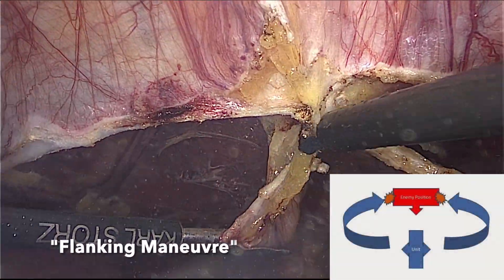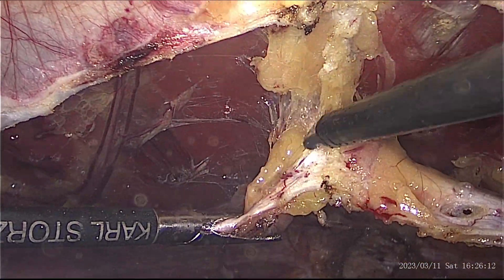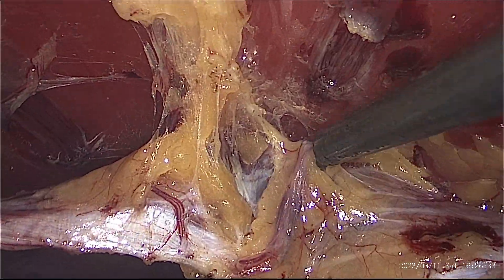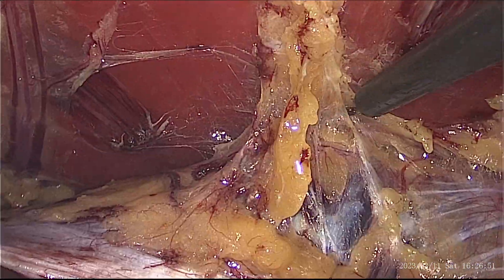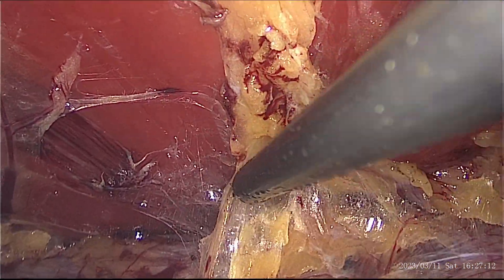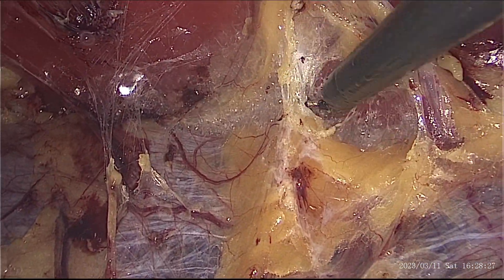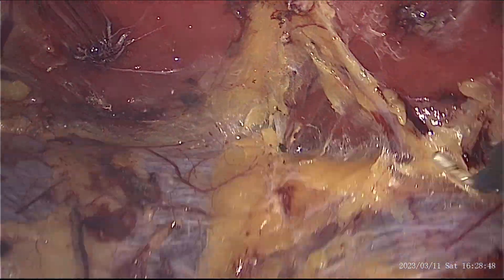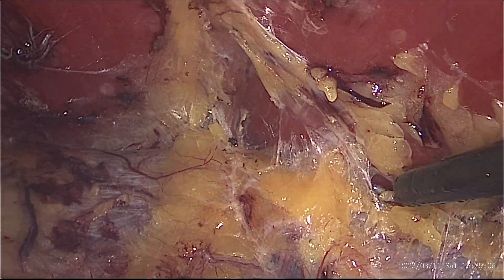Creating both retromuscular spaces helps in preserving the linea alba on the anterior roof. The inferior epigastric vessels have to be preserved on both sides and have to be pushed upwards with the roof.